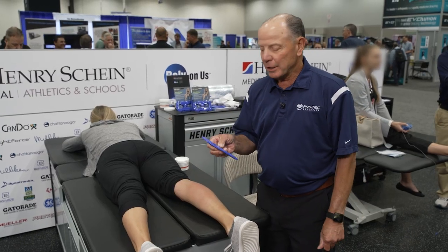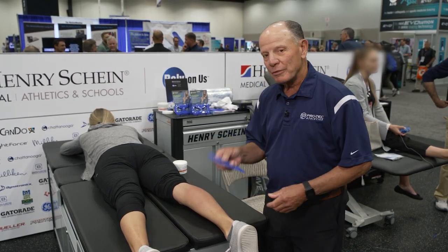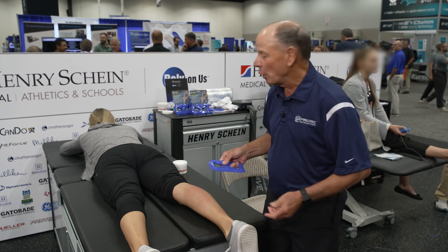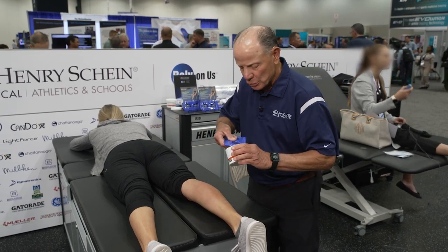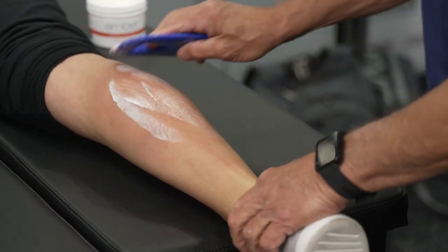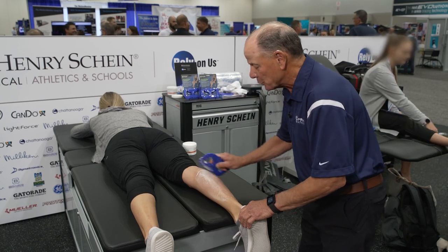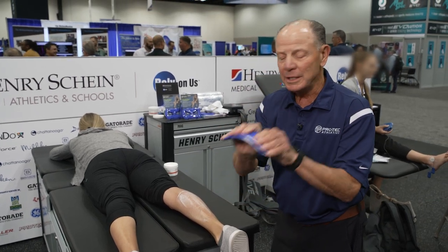Another technique I could use is a stroking or scraping technique on a body part. In this technique I need to use lotion, so I'll take and put a little bit of lotion on the instrument. I'll scan the tissue feeling for inconsistencies in the soft tissue and then treat it. I'll start with a two-handed technique.